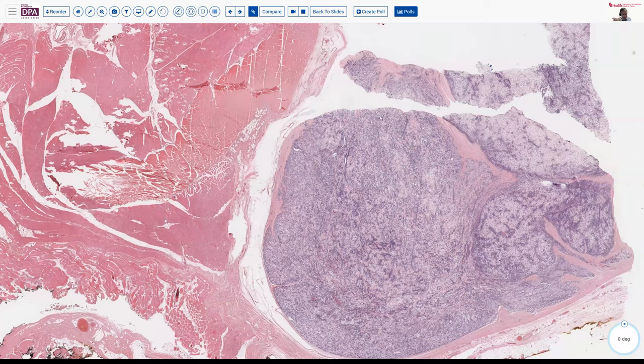But if you have a resected lesion, say from a muscle or something like that, typically there will be some degree of zonation where you'll see at the periphery one particular type of morphology, and the center will be of a different morphology. And so that can be helpful in terms of that differential. So I use that morphologically along with the degree of atypia and pleomorphism, which I think is usually greater in osteosarcoma than in myositis. But myositis ossificans can be very mitotically active, and so it could be a consideration there as well. So good questions.